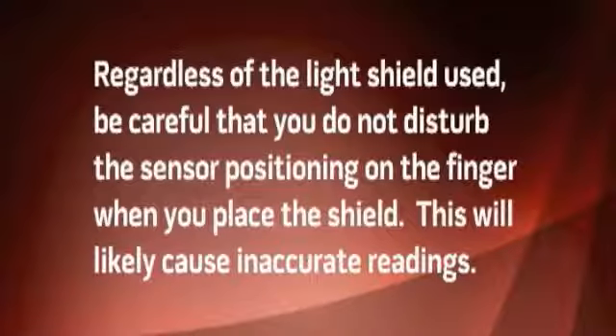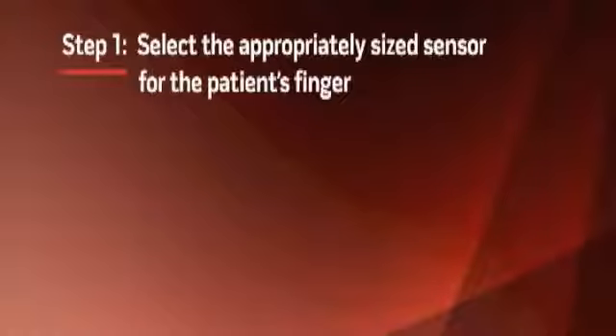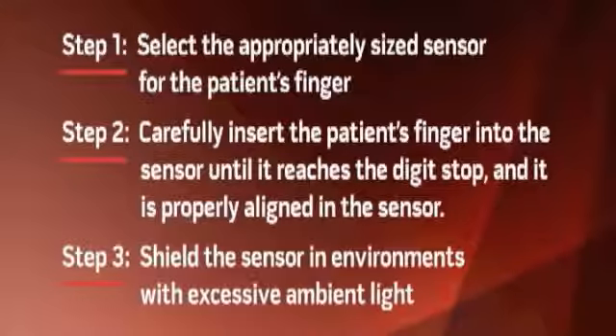To review, proper rainbow sensor application is achieved by following these simple but extremely important steps. Step 1: Select the appropriately sized sensor for the patient's finger. Step 2: Carefully insert the patient's finger into the sensor until it reaches the digit stop, and it is properly aligned in the sensor. Step 3: Shield the sensor in environments with excessive ambient light. For more information about sensor placement and operation, consult the directions for use included with your sensor.